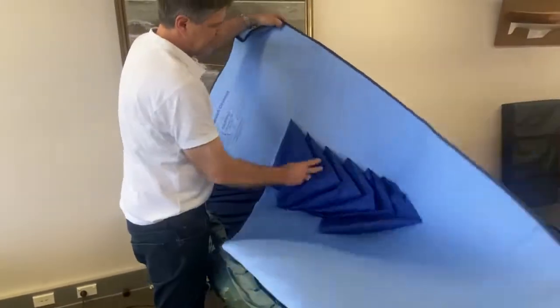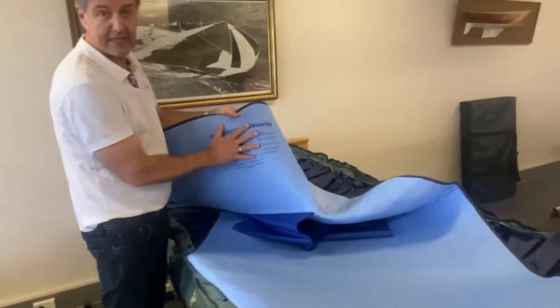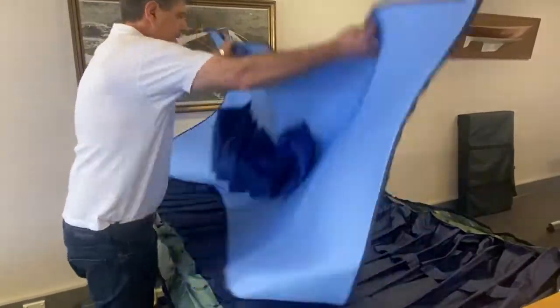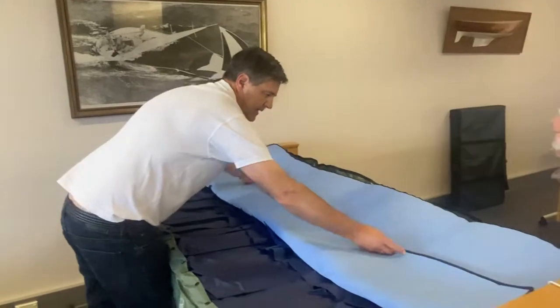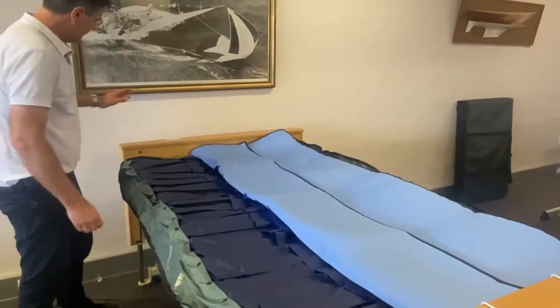You'll notice that there are cell flaps underneath and that there is a print here. This print goes on at the head end. So we align it to the head end, like so, and then we fold it back so that you can see the cell loops.